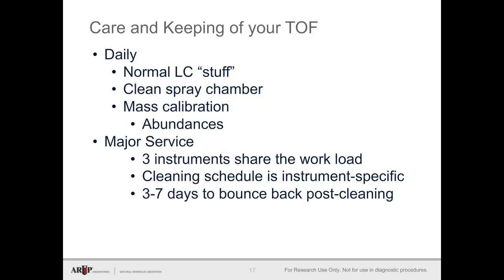We are fortunate because we have a factory-trained service group of engineers in-house, because we have over 100 mass specs of all shapes and sizes and brands in the building that they are capable of fixing and maintaining. So when one goes down, help is not far away. But like I said before, the key is paying attention to changes in the system and acting on them before things become a crisis. Set criteria that meet your needs and get help before it blows up in your face.